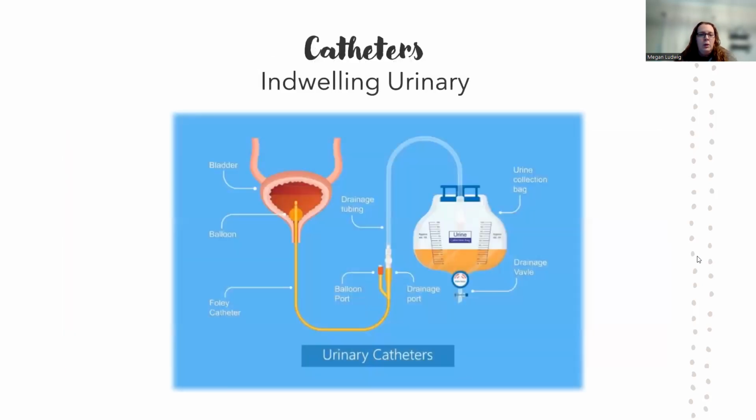Okay, so here's your indwelling Foley catheter. This is your typical Foley right here. So this is how it sits in the bladder. It's inflated with a balloon. You have a syringe in your Foley kit that is usually, depending on the size of the balloon, probably this is a 5 cc balloon. You'll have 10 cc's of sterile water, not saline, sterile water, okay? So you inflate the balloon with sterile water, 5 cc's end up in the tubing and 5 cc's end up in the balloon.